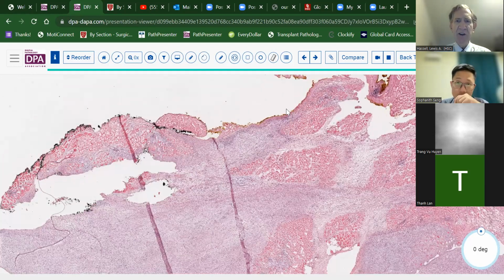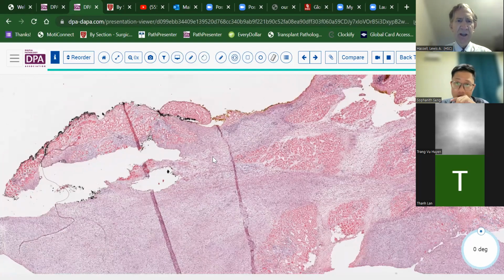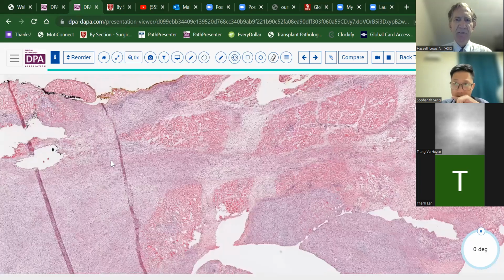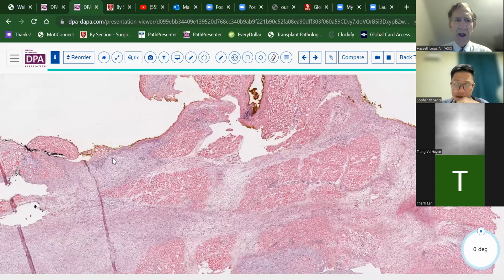It's certainly close enough here that, within the realm of uncertainty, the surgeons should consider that that margin is going to be a likely source for recurrence. And of course, the types of tumors can make a difference as well.